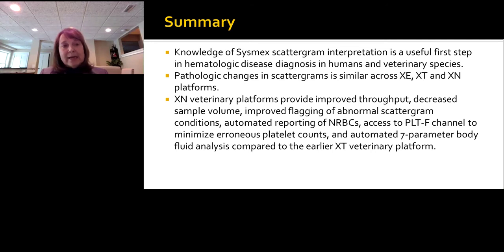And the example I can give is in my past life, we actually supported an aquarium. So the question came, well, can you do a CBC on a shark? Can you do a CBC on a whale? How about a sea lion? And the answer became, yes, we can do it on all of them. And were they the same? No, they weren't. But it allows you flexibility, which you really need in a veterinary world.